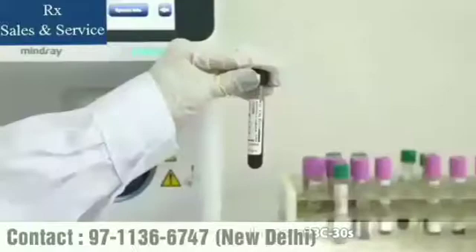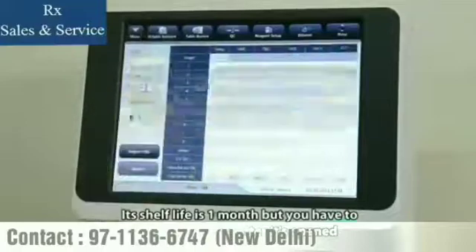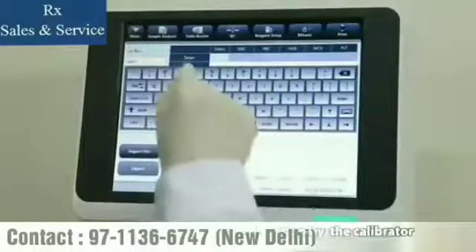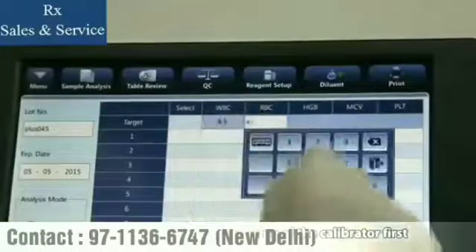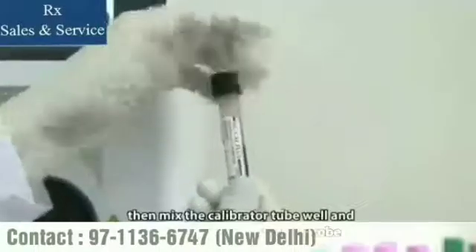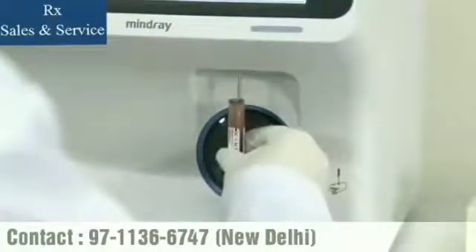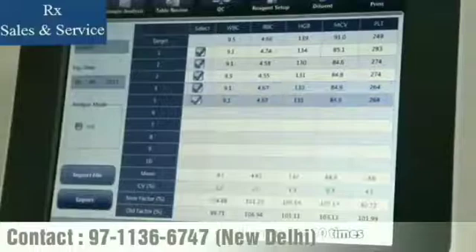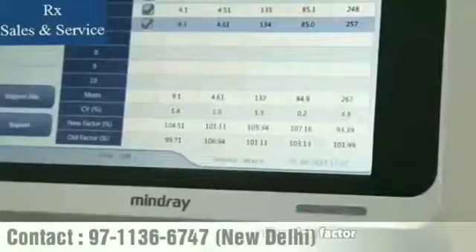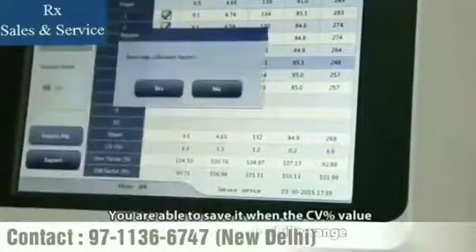SC Cal Plus is the calibrator for BC-30S. Its shelf life is one month, but you must use it within seven days after opening. We recommend running calibration using the calibrator. Input the target value of the calibrator first, then mix the calibrator tube well and run it through the sample probe. After running the calibrator five to ten times, you may obtain the new calibration factor. You are able to save it when the CV% value is within the reproducibility range.